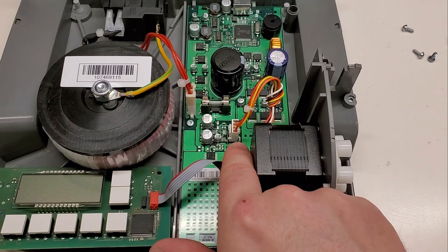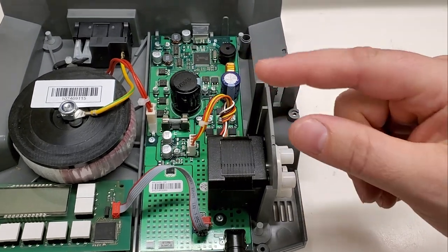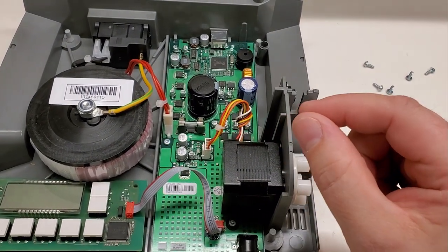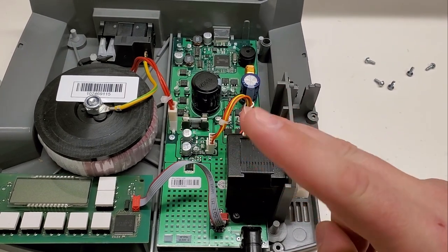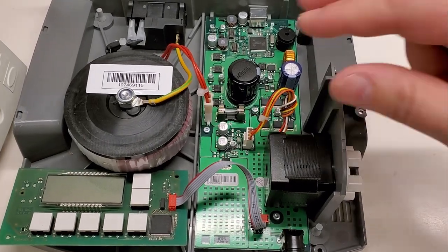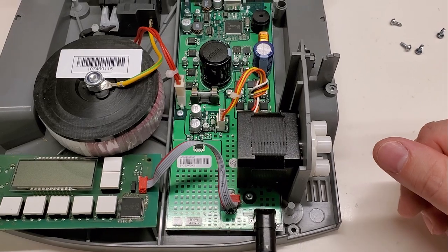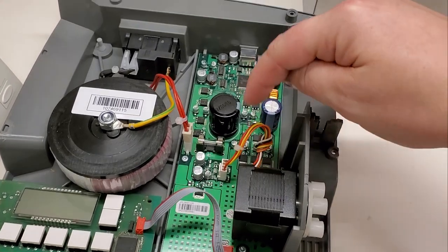Now you can test the pulses that come out, because that's what it is, you have DC that comes out, and DC runs most motors, but what it is, it pulses the DC, so it looks like a square wave. And it pulses it, and the faster the pulses, the faster the motor spins. So you can imagine that you go nice and slow, the motor goes slow, and then the faster it goes, the faster the motor spins. And that's basically what this does, it increases the frequency of pulses, and that's how the motor increases its speed. So that would be a dumbed down system with one stepper motor, your stepper driver.